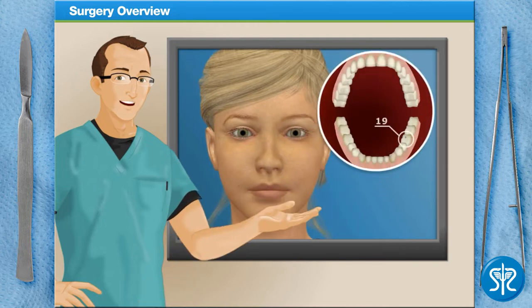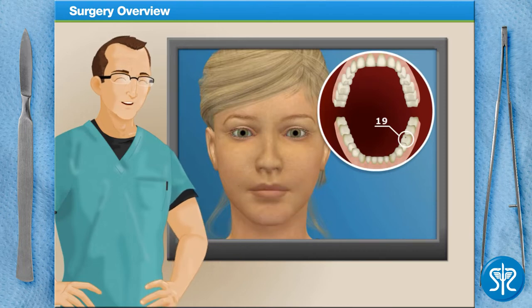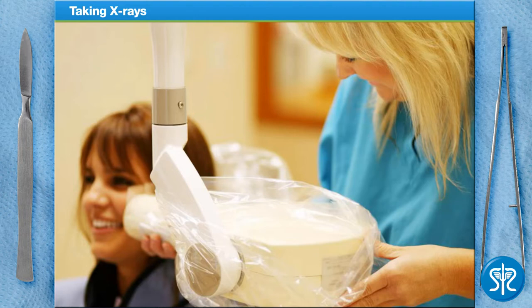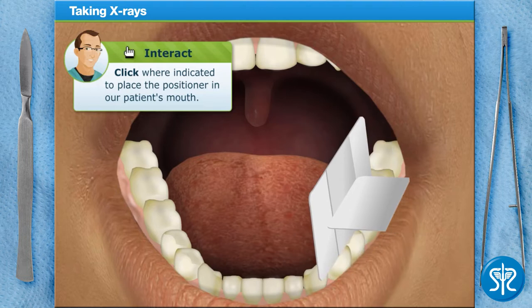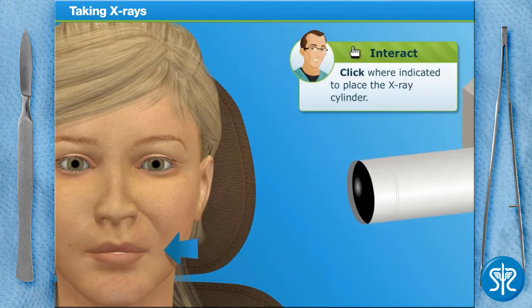Our patient today has been experiencing some slight discomfort in their lower left second molar, or as dental professionals might say, tooth 19. Before we begin, we need to get some x-rays taken of our patient's teeth. X-rays, or radiographs, are essential low-cost diagnostic tools used to examine a tooth's roots, check the health of the bone surrounding the tooth, observe the status of developing teeth, and find abnormalities such as cavities. Let's get started — first, insert a positioner into the patient's mouth, then position the x-ray cylinder where indicated.